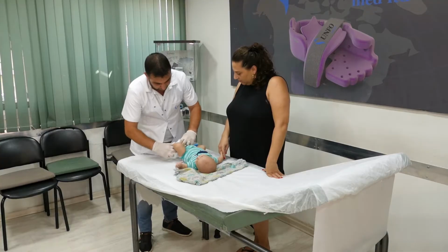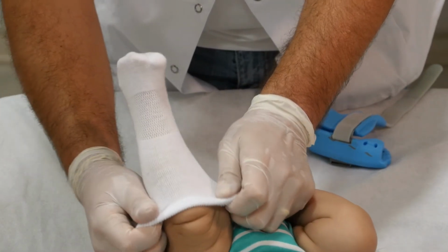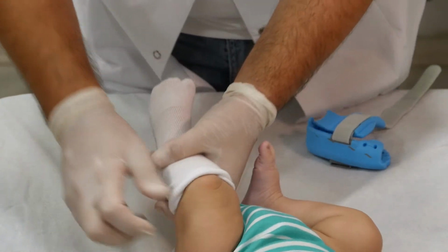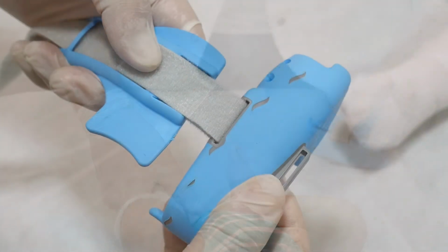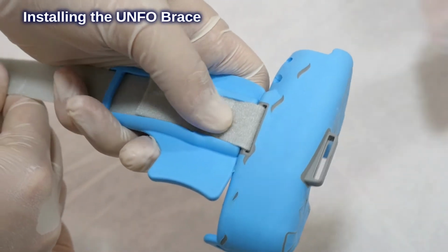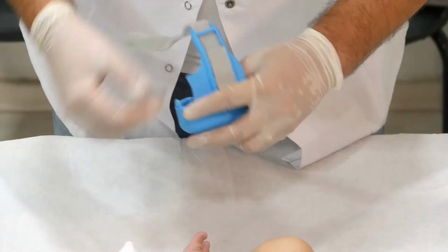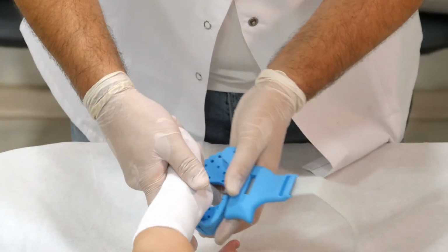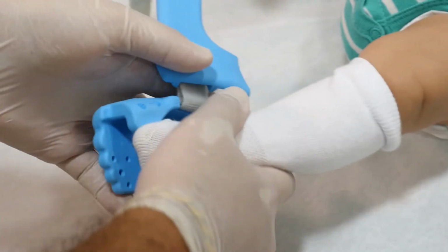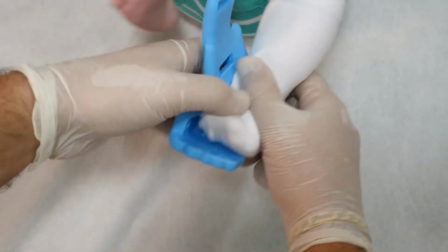It's very important for the sock to be 100% cotton, tight, and folds-free. Folds might cause redness around their area. Before the setup, place the cushion as close as possible to the brace's body. After bringing the cushion and the brace's body together, hold the foot and place the heel in its position directly. Hold up the toe fastener and insert the rest of the foot.